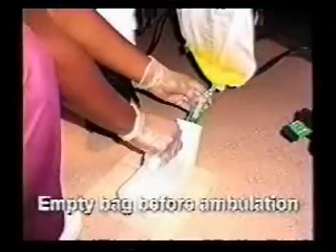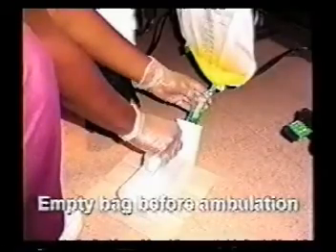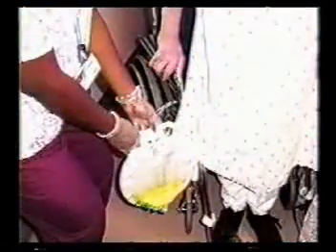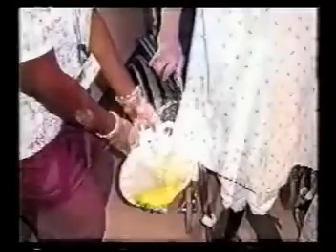Empty the patient's drainage bag before ambulating or transferring the patient. Move and transfer the patient carefully so as not to dislodge the catheter by pulling on the tubing. If the patient sits in a wheelchair, the drainage bag must be attached under the seat of the wheelchair. The caregiver is responsible for observing the characteristics of the urine and the condition of the catheter and drainage equipment.